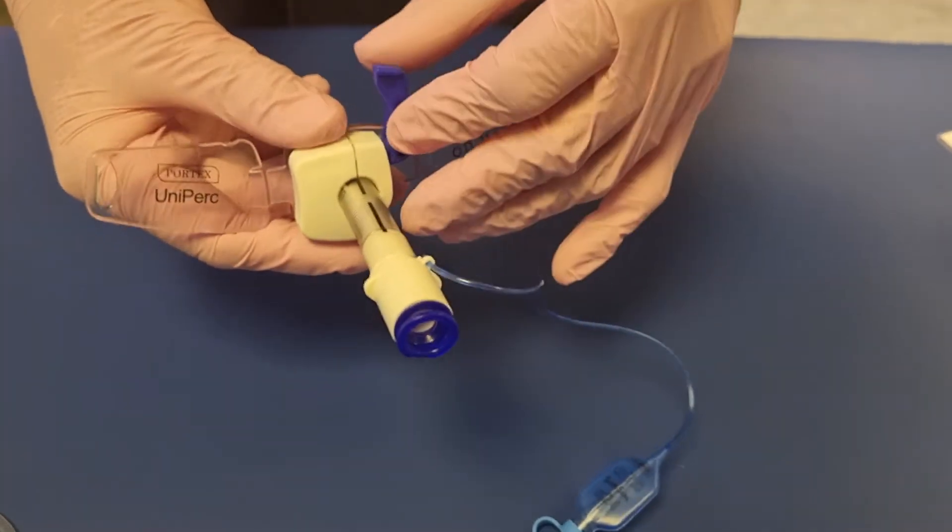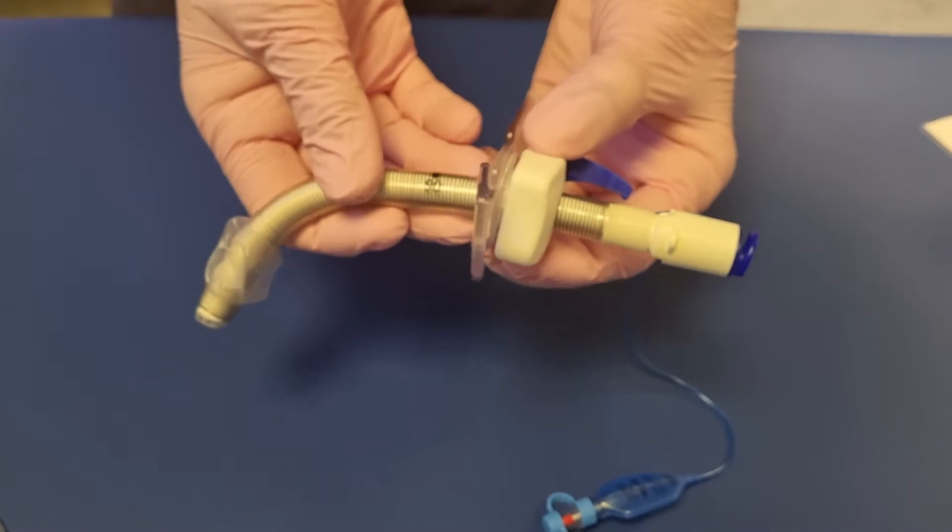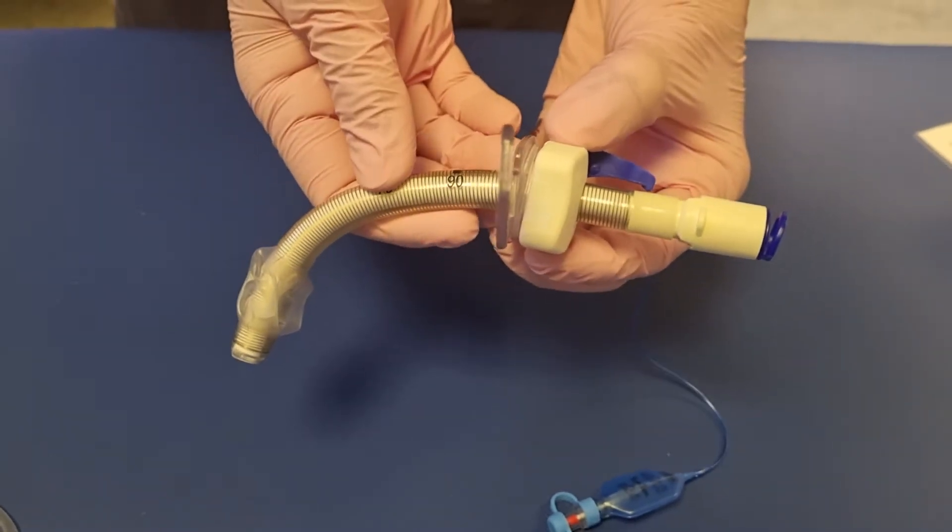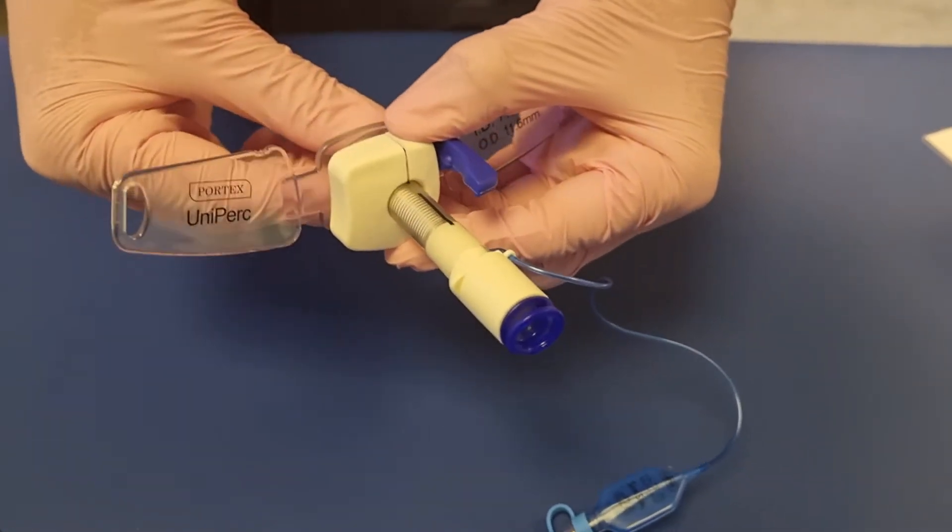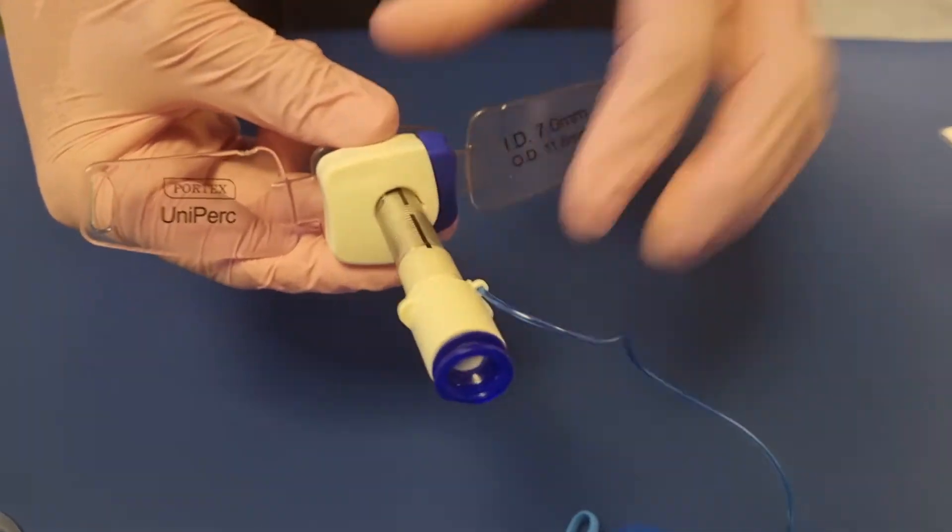The adjustable flange part allows us to make the tube as long as necessary to insert fully into the trachea, and it is then fixed into place with a locking system.